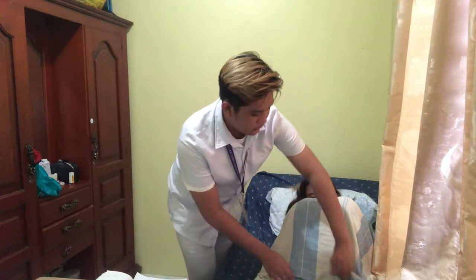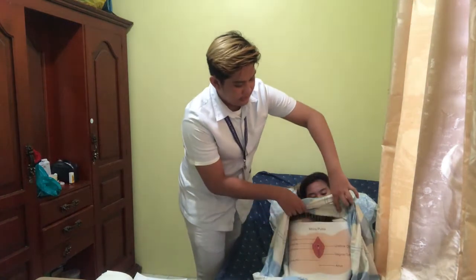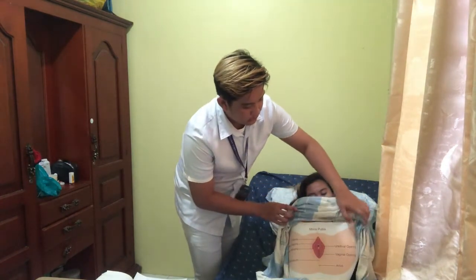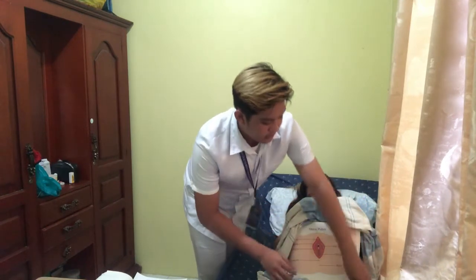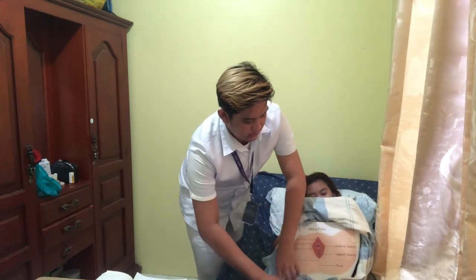Okay, I am going to expose the area that we need to expose. We'll hide the others.